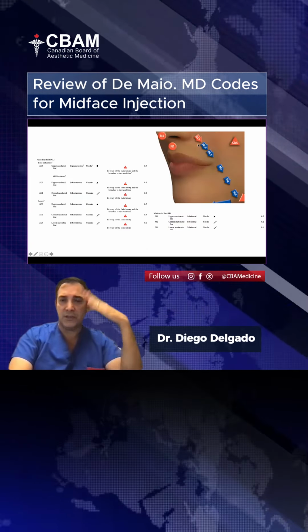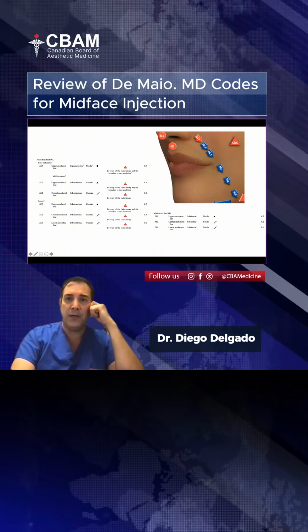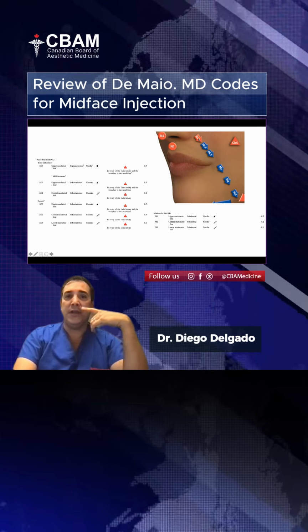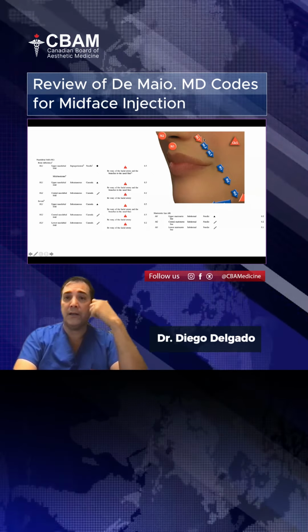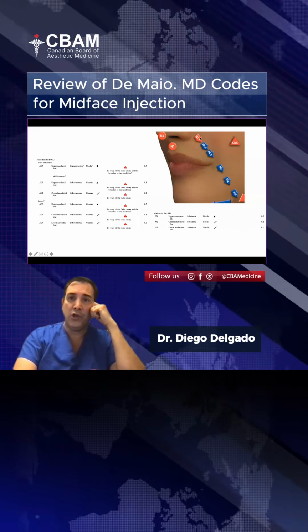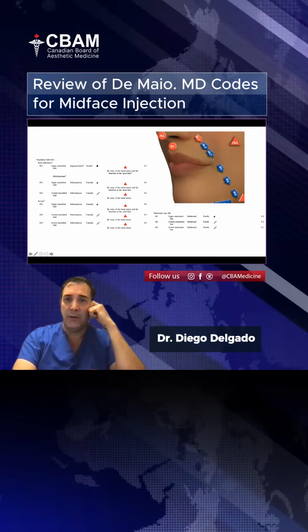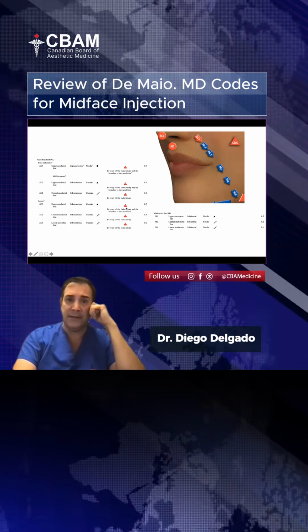And here, just going more into the lower face, and I don't want to go into detail in that area, but here the nasolabial is another area you can treat depending on the degree of bone deficiency, depending on how deep are the lines in the nasolabial fold. You can use deep periosteum needles or cannulas that you can go from half a syringe up to 1 syringe, depending on each case.